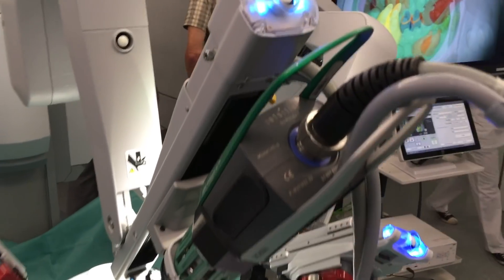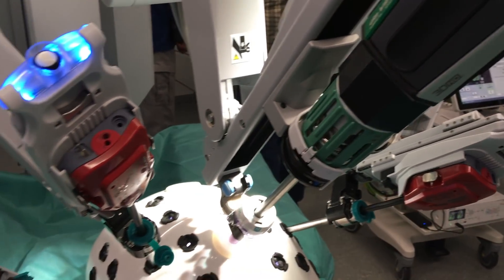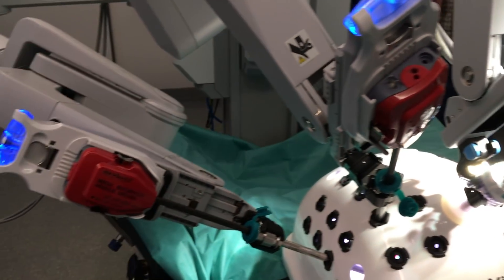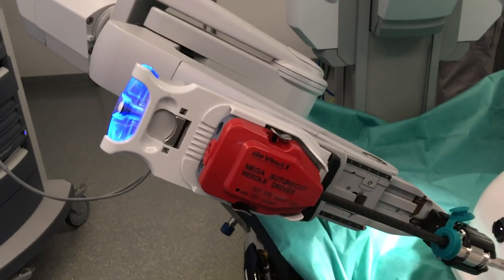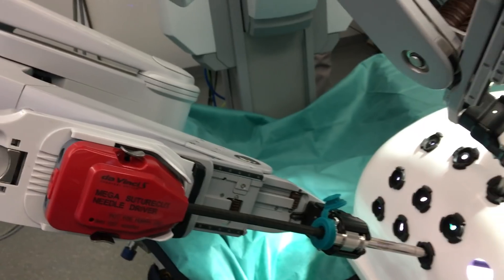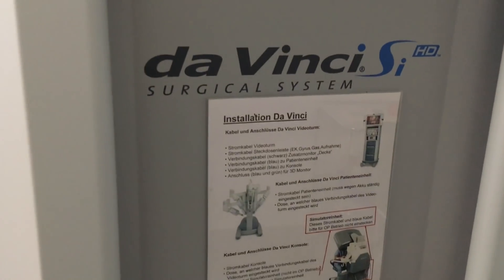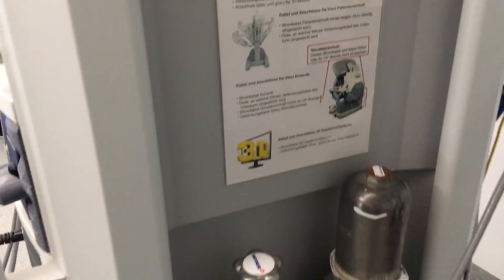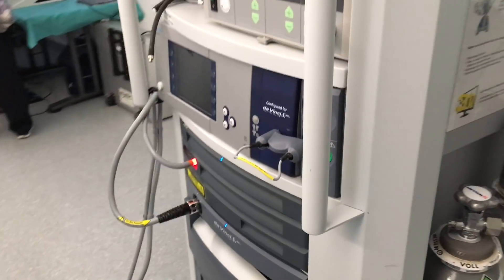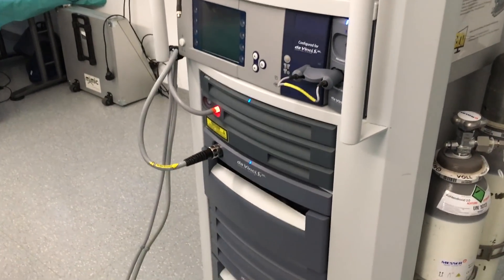Here you see the 3D endoscopic camera that is mounted on its own robot arm and can be moved like all the other instruments. This is the robotics control computer cabinet with some endoscopic medical devices on top.